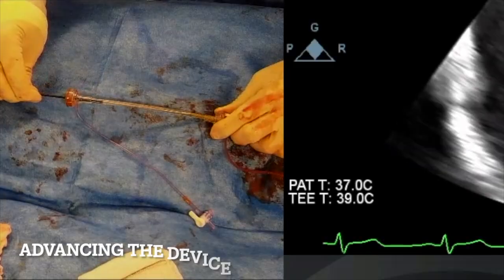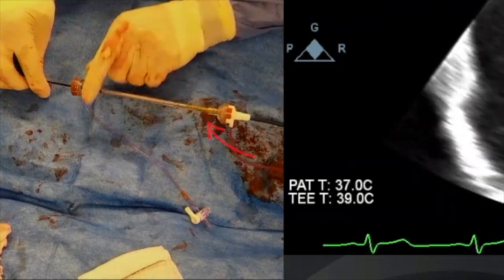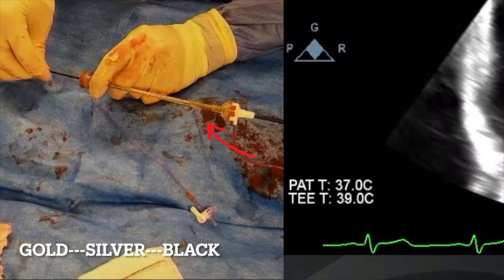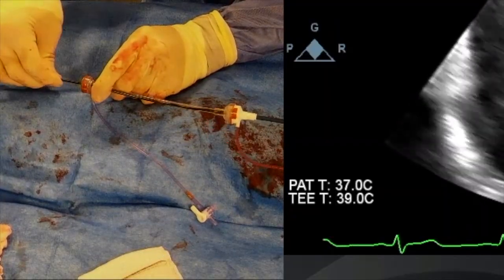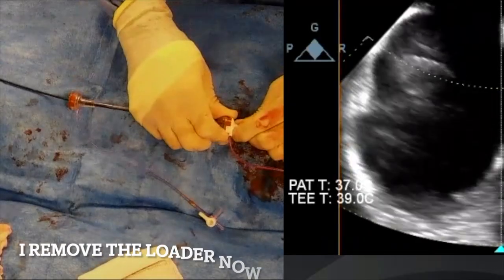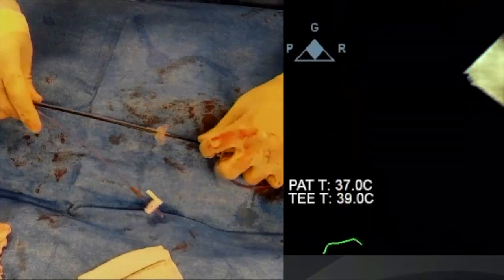I've put the loader on and I can see the gold device, the silver and the black, and then I'm going to slowly insert the device. So the gold goes in, the silver cable goes in until the black is in. And once I've done that, I detach the loader completely. It's got no purpose now.